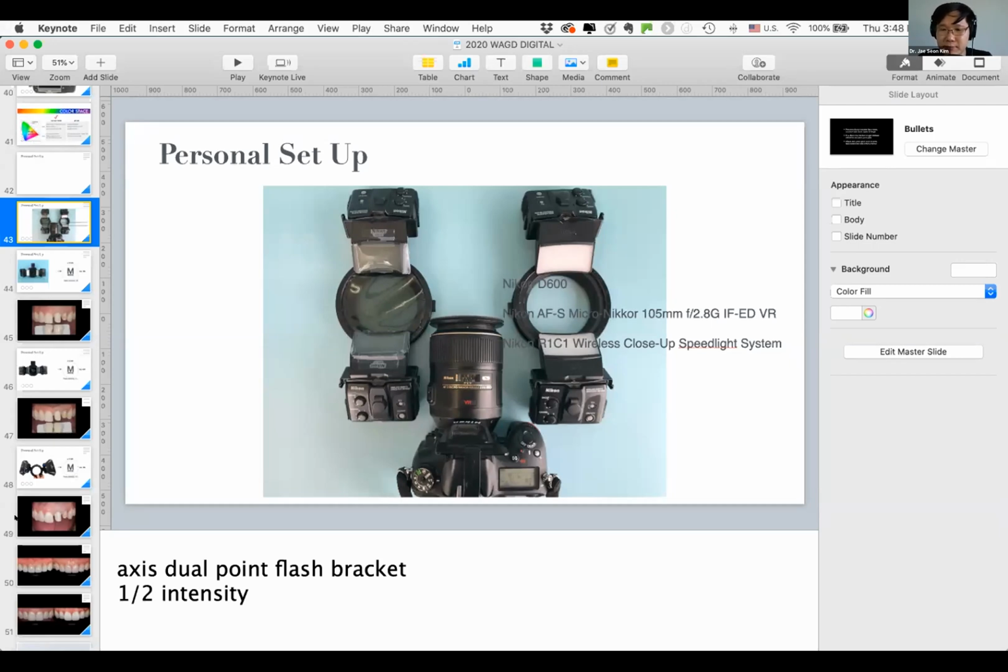Okay, this person's asking, do you use a clear lens protector attachment? If you do, how do you get the flash to click into that attachment? So having a little problem with the equipment there. The lens protector. I think what they're getting at is once you screw that lens protector on, your flash bracket won't mount the same way. So I think they actually need an adapter. Yes, you just need to get a different adapter that can go on top of the clear lens protector.